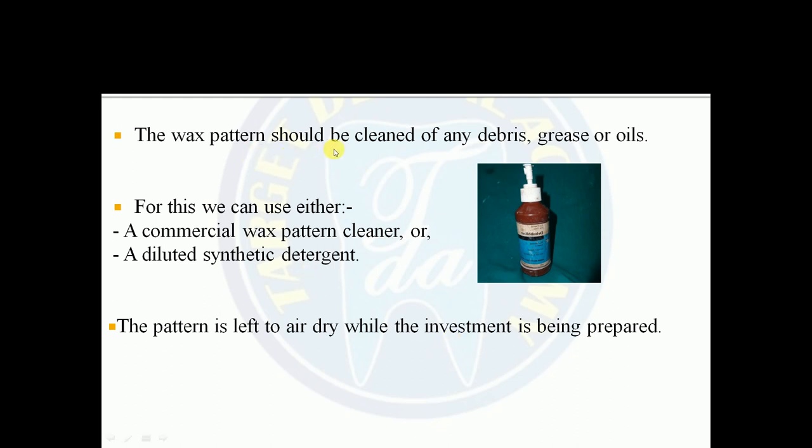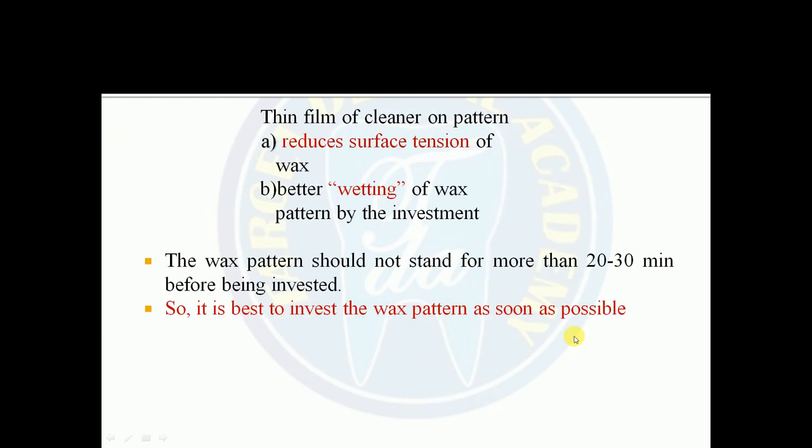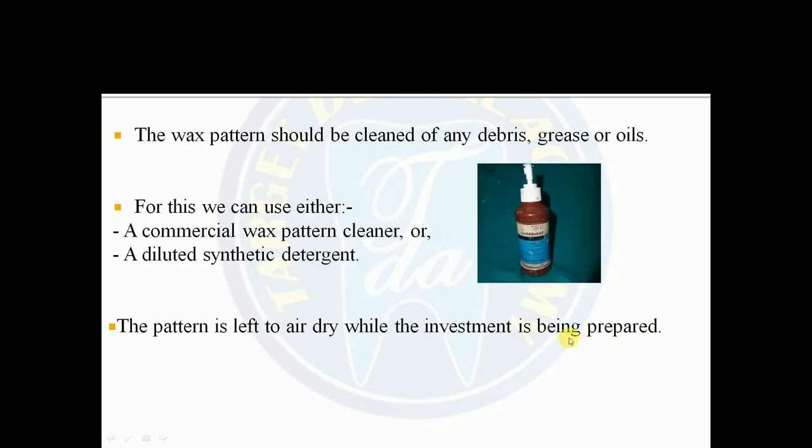So the wax pattern should be cleaned of any debris and grease or oils. For this, we can use either a commercial wax pattern cleaner or a diluted synthetic detergent. The pattern is left to air dry while the investment is being prepared. So how is the investment prepared? Your powder, you can mix the powder into the liquid.